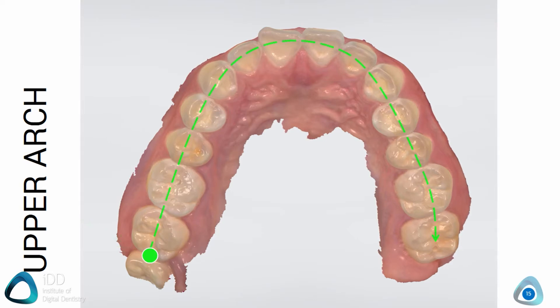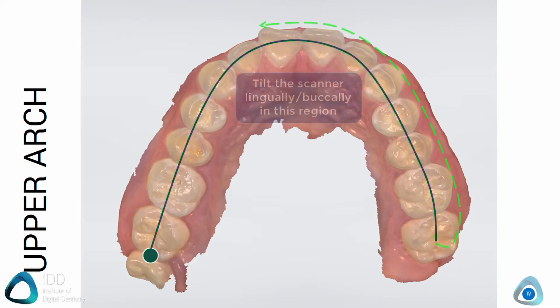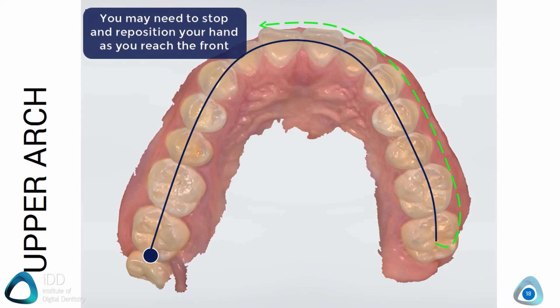From the last molar, move to the occlusal aspect of the molar on the other side of the arch in a smooth and steady motion. When you get to the anterior aspect, it's common to have to tilt the scanner slightly lingually or buccally so that you don't lose alignment. Once you're at the other side, tilt lingually or buccally and move towards the anterior aspect, also capturing the buccal gingiva. You can reposition, then place the scanner in an area already scanned and it will recognize this and pick up the scan as normal.